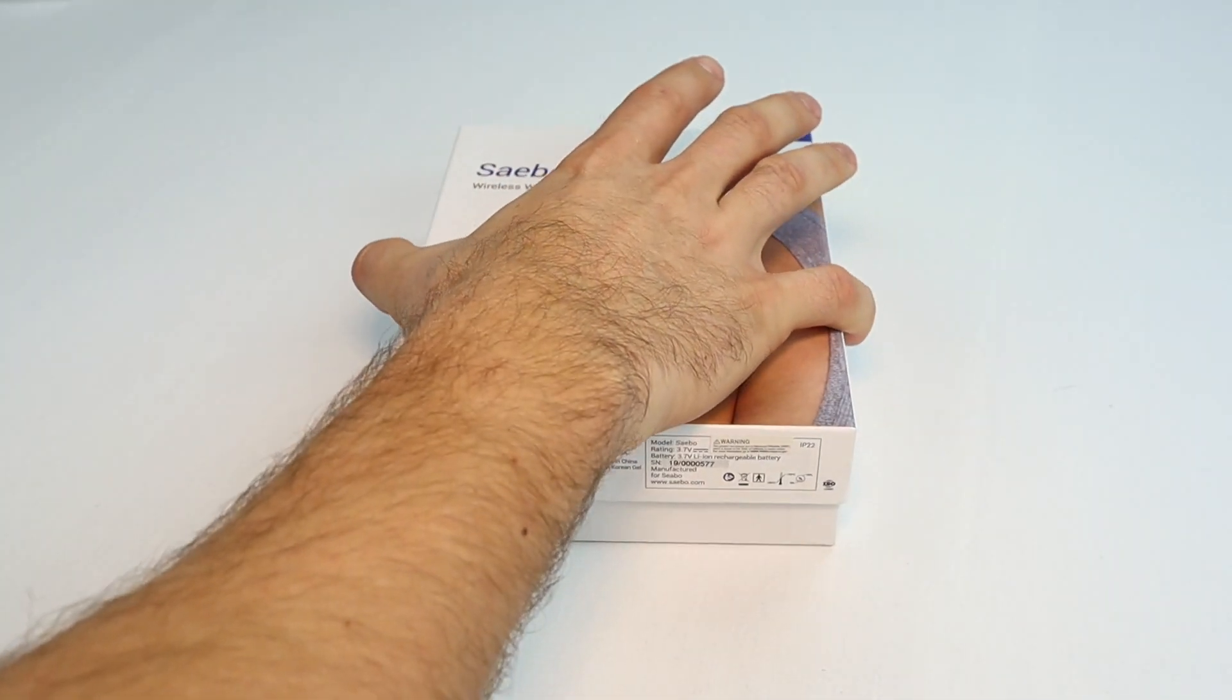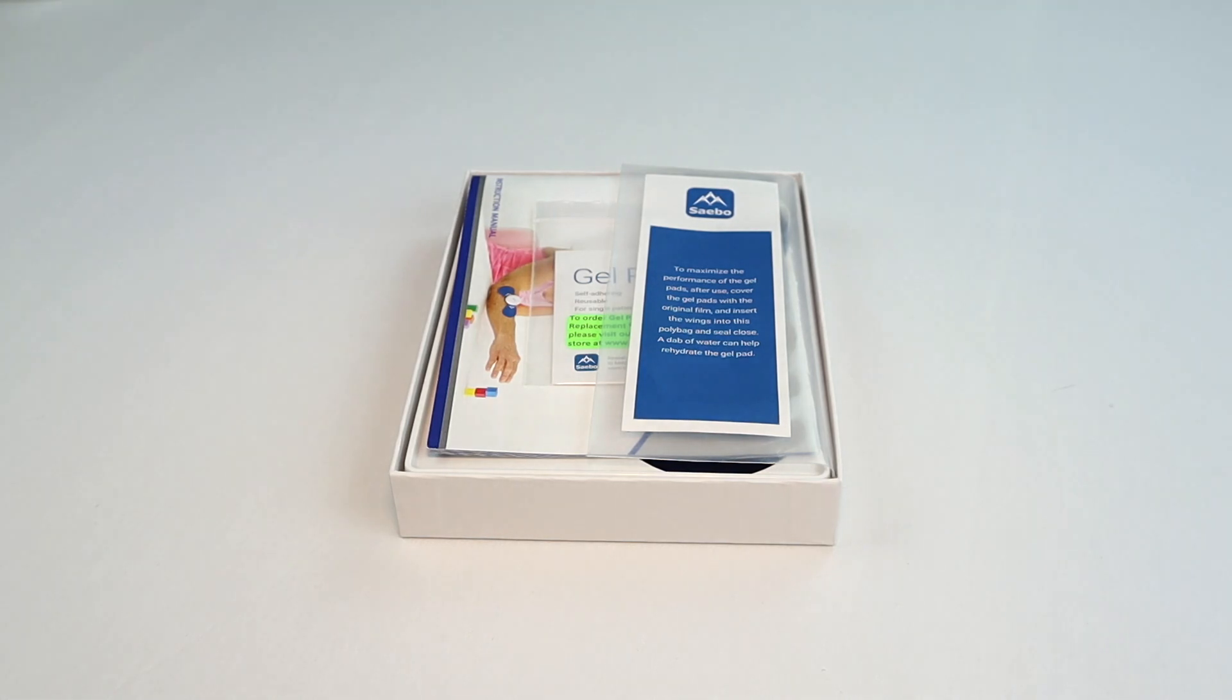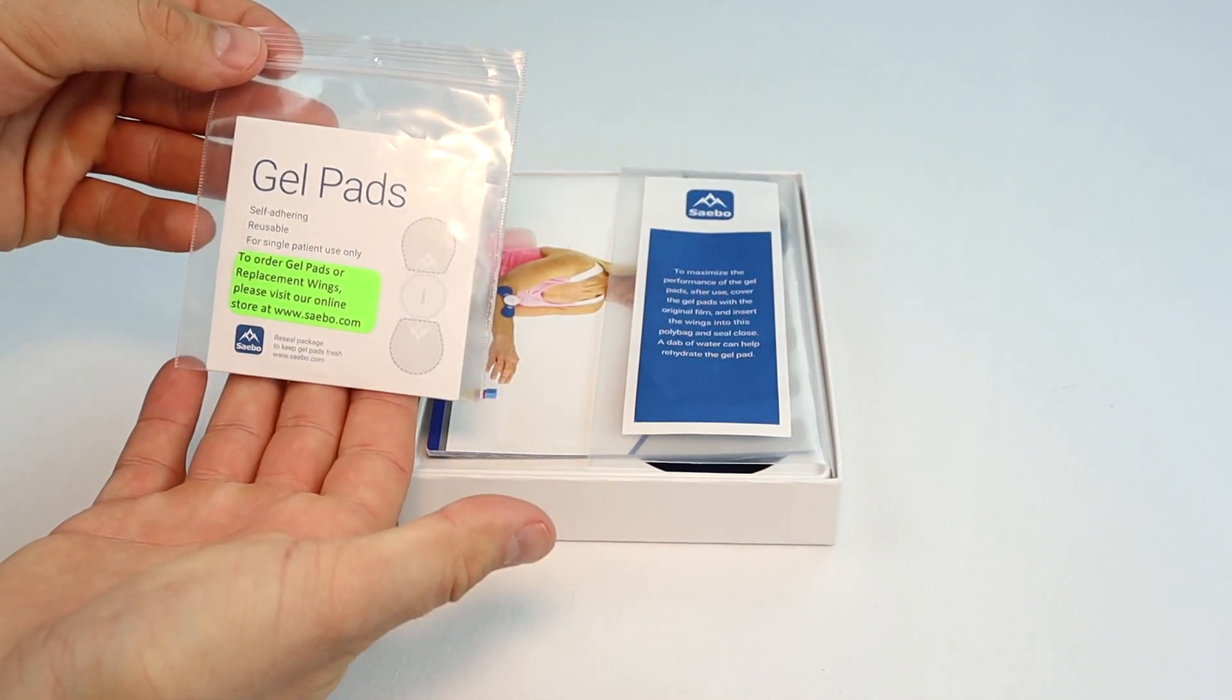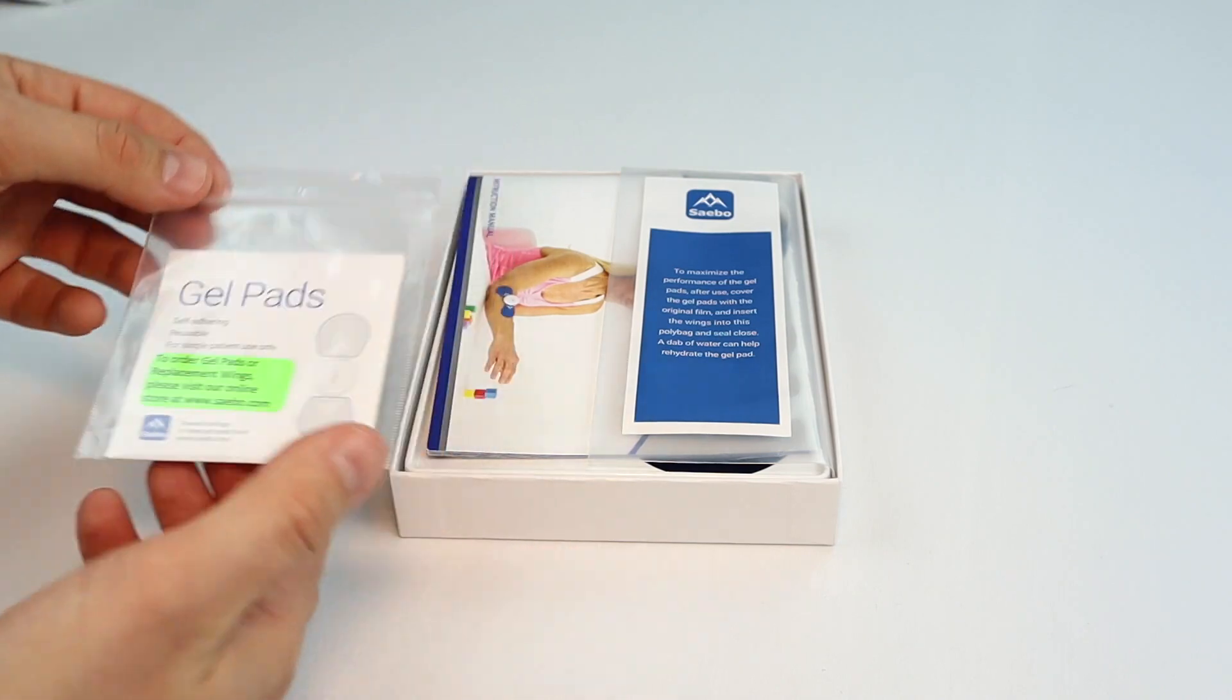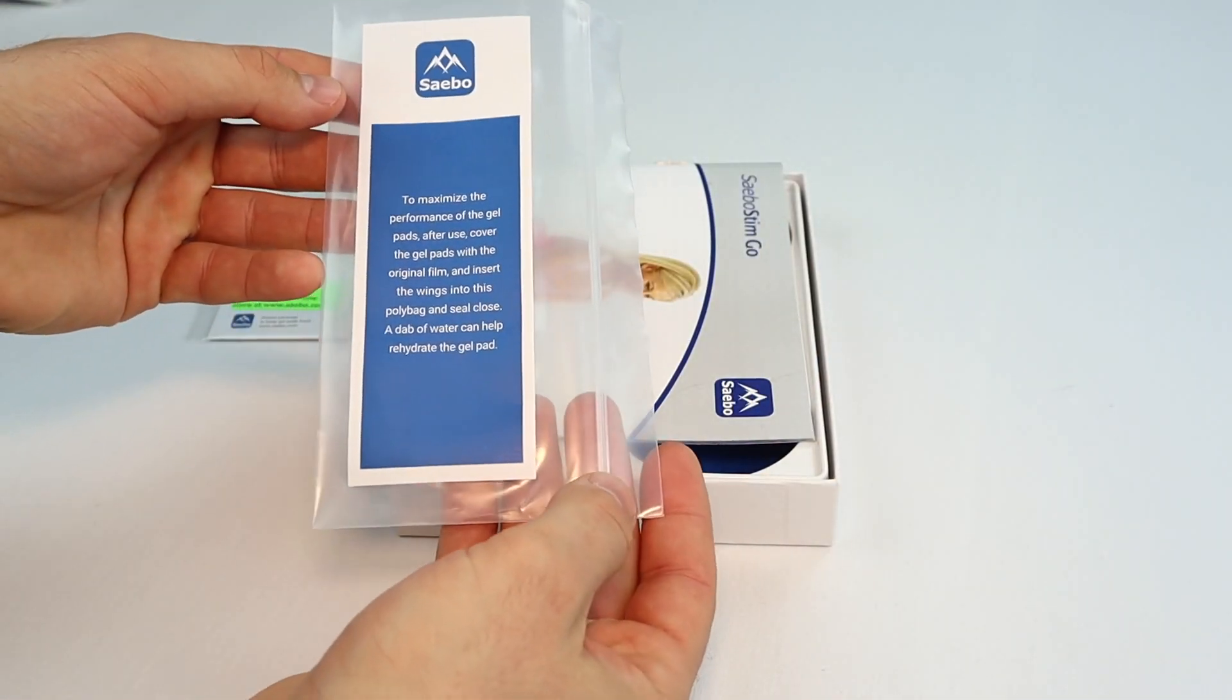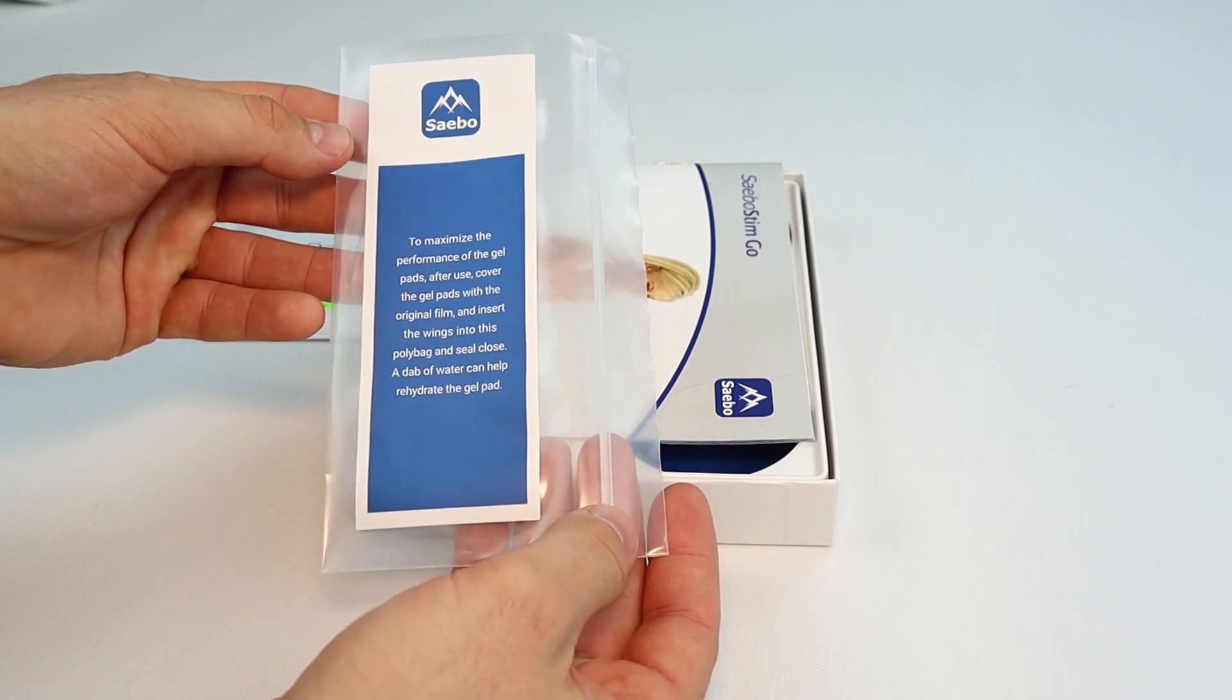To open the box, lift up on the cover and remove it. Here are the gel pads that we will apply in a minute to the wings. Here is a poly bag for keeping your wings and gel pads clean as well as getting the most use out of them.